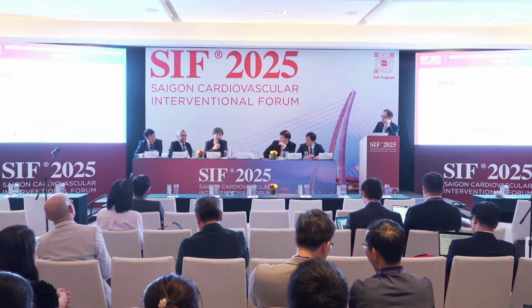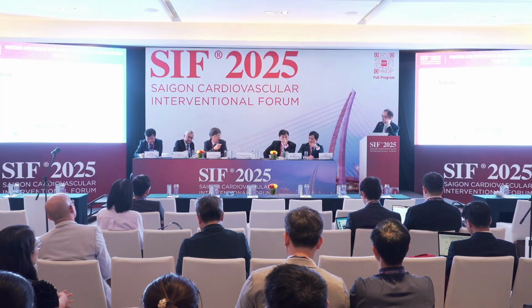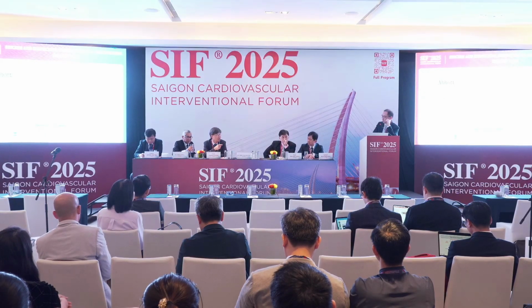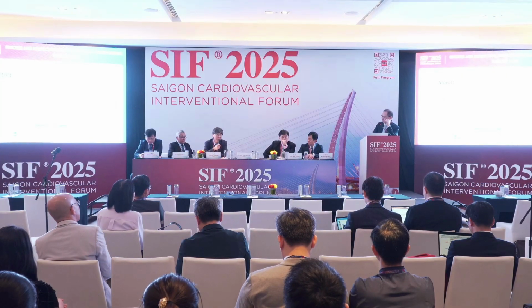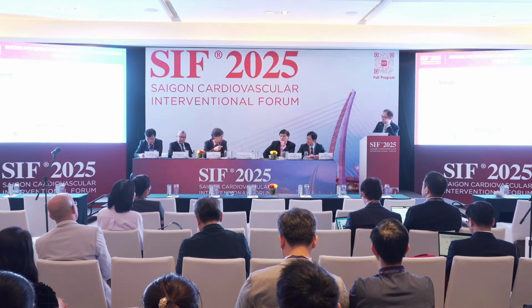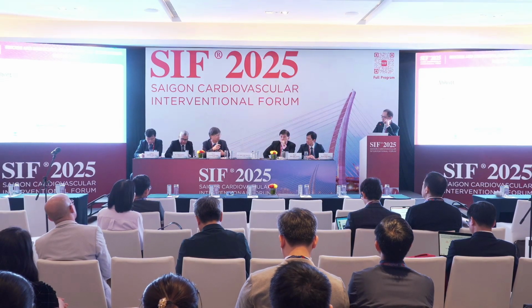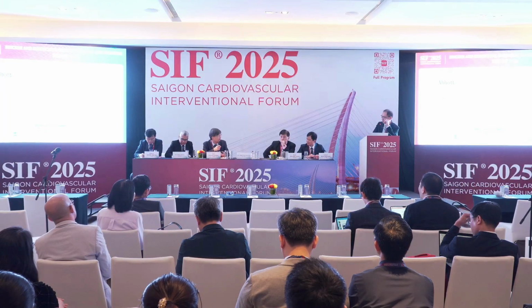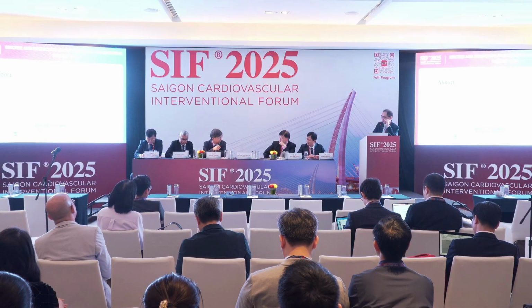You show us the very dramatic cases. One of the principles in Dr. Han's presentation, we will do the one stent or two stent. Imaging is very important, but in your presentation, I didn't see any imaging before the procedure. And the lesson from your first case, there is a hyperacute angle and the calcium. Okay, this is a good indication for the rotablation, and the final result is acceptable for me, but very fearful appearance. So the lesson is, do not do the rotablation in similar cases.